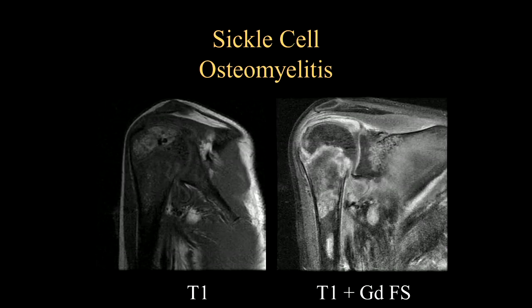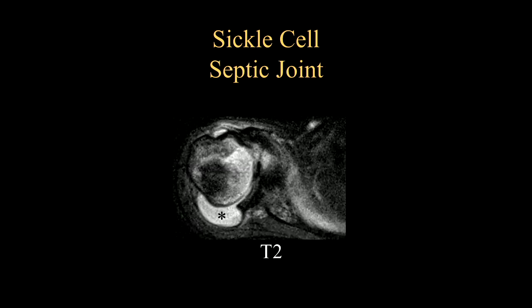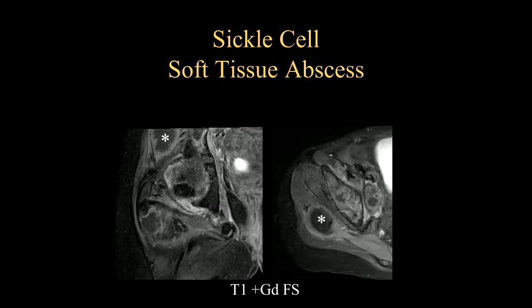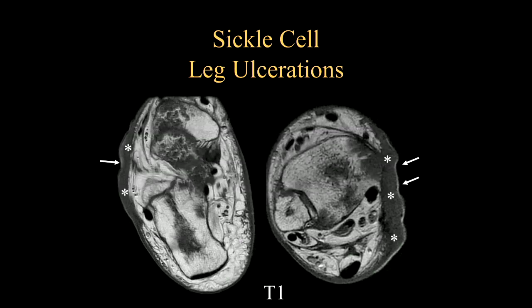Here's a patient who has sickle cell osteomyelitis. Looking at the T1 and T1-enhanced images on the right, you can appreciate the abnormal replacement and abnormal marrow enhancement in this patient with infection due to salmonella. Here's a different patient where you can appreciate this large glenohumeral joint effusion, which also proved to be septic arthritis with salmonella infection. Soft tissues can also become infected and can have areas of infarction. In this case, this was a seated salmonella abscess within the gluteal muscles of a child.